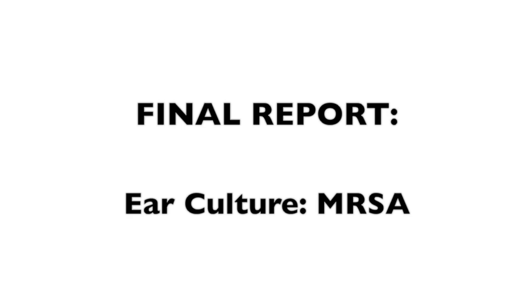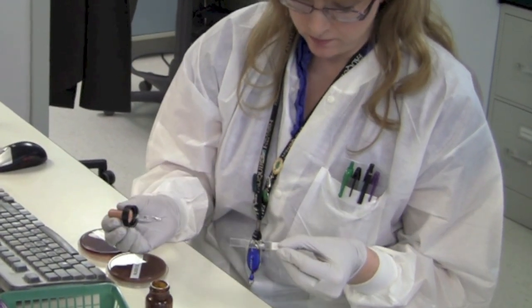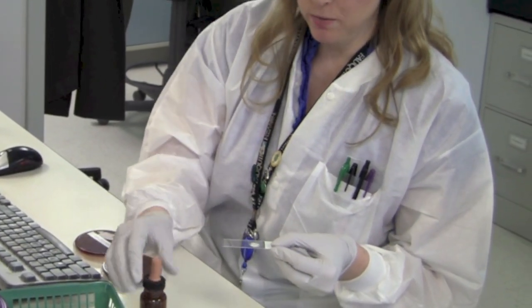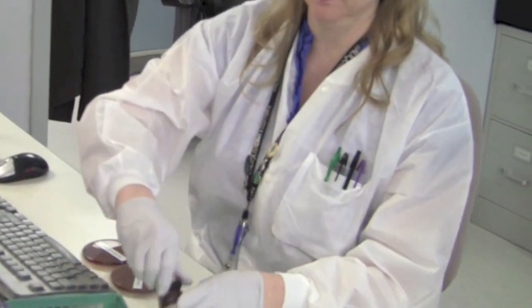For the ear culture, it was found to be MRSA. The blood culture obtained from our second example did not end up revealing any infection in the blood. This culture and sensitivity process applies to any culture obtained from anywhere else in the body.